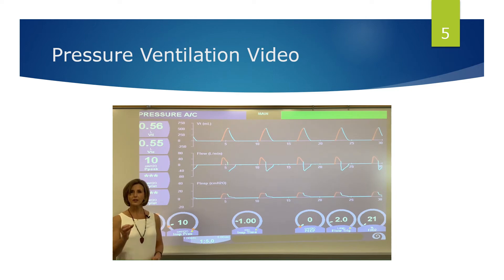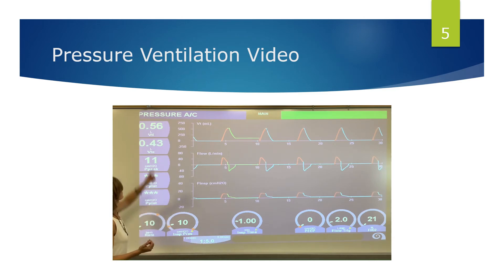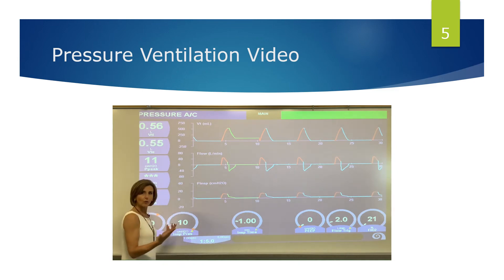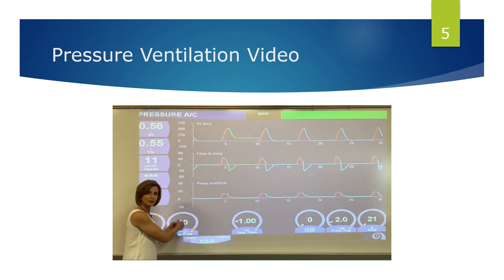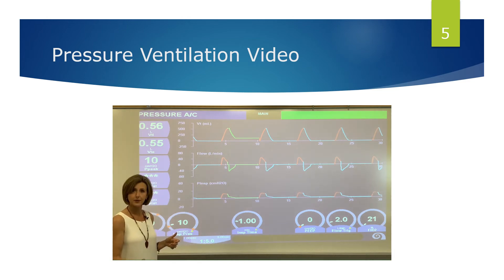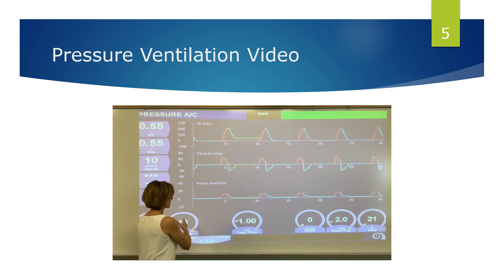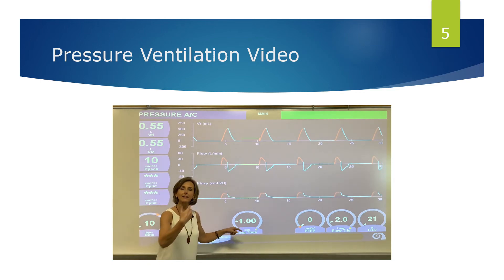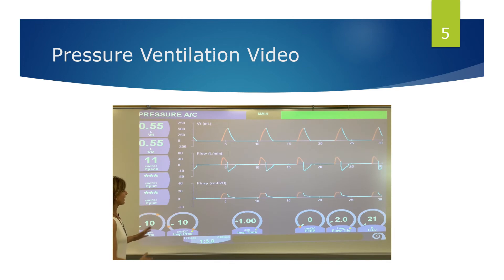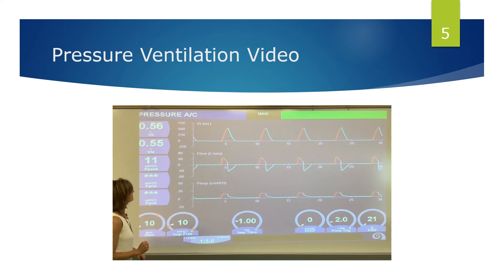In this video we're going to demonstrate pressure ventilation. The machine is in pressure assist control mode. The circles at the bottom are where I've set my settings: a rate of 10 and a set inspiratory pressure — in pressure ventilation we set the PIP and it won't change. I have a peak pressure set of 10, and I'm going to hold that pressure in the lungs for one second and then allow the patient to exhale.